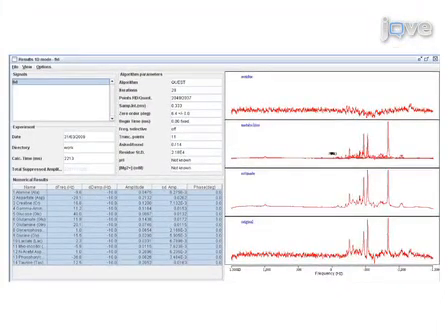Quest fits spectra using a linear combination of individual metabolite spectra to perform a least squares minimization between the simulated and actual spectrum. We use a basis set of 22 individual metabolites as potential contributing factors. Basis spectra are simulated and validated using spectra of solutions of individual metabolites.